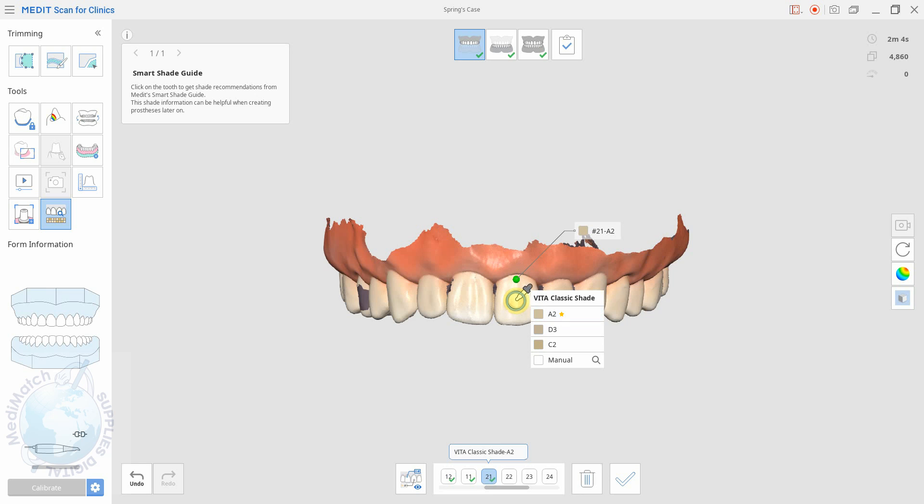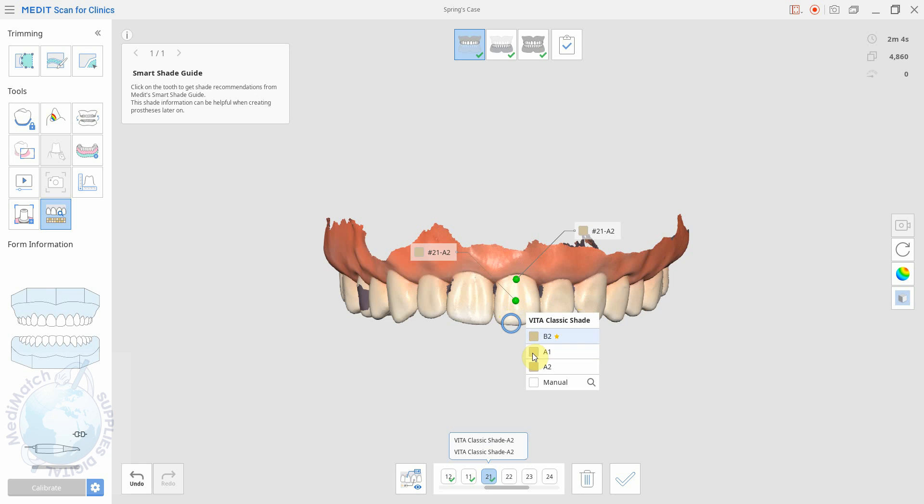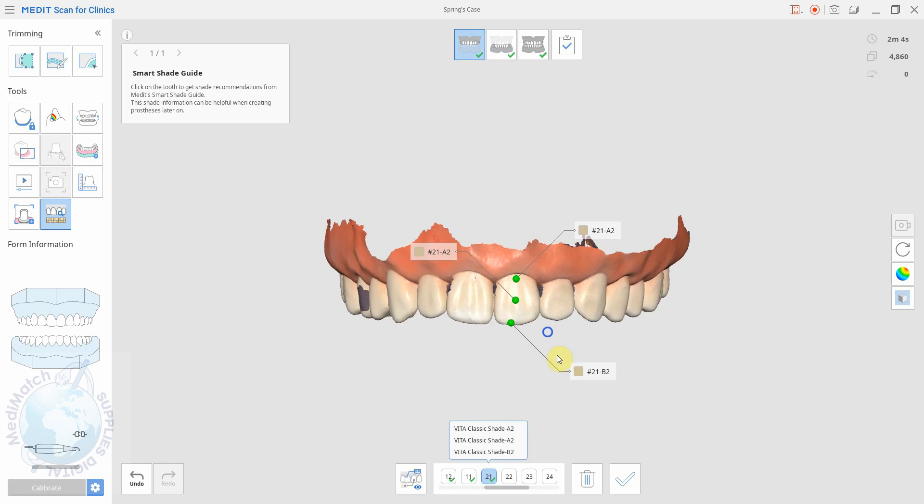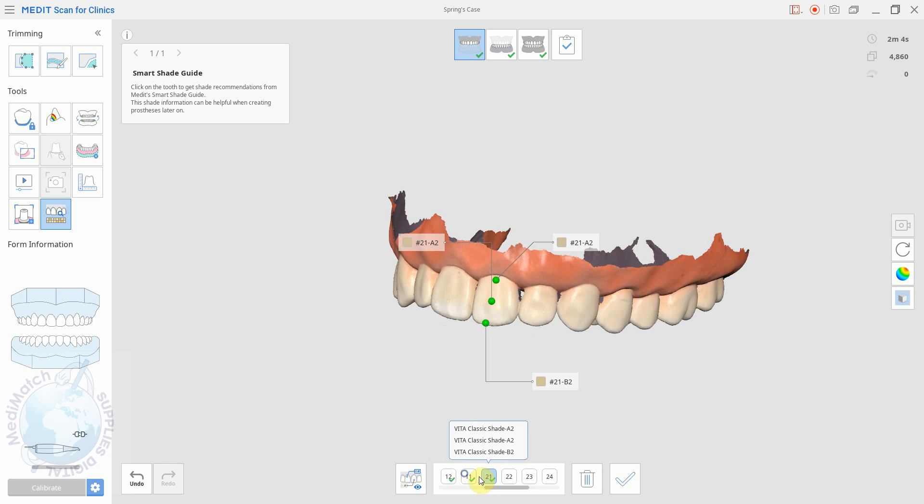do another point. Let's do one in the middle, so A2 as well. So we'll click it again, and we'll do one right on the tip and that's B2. So we can click it, save it, and they're all saved against that tooth number. We can click on another tooth and do the same.